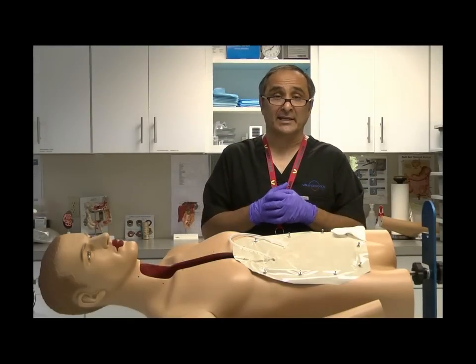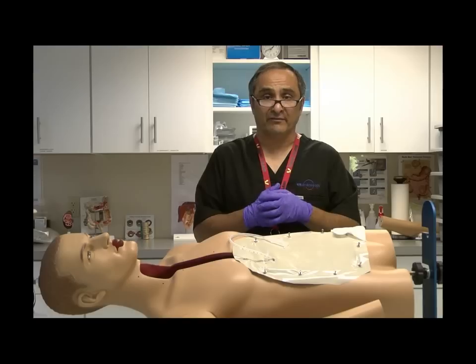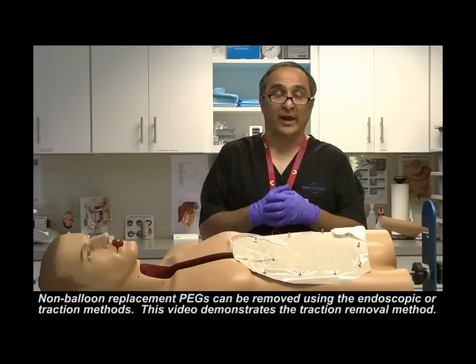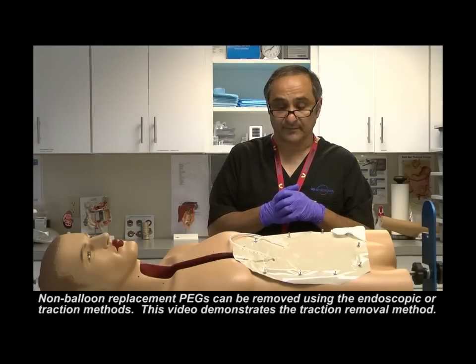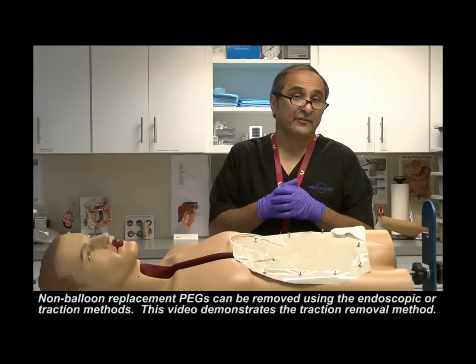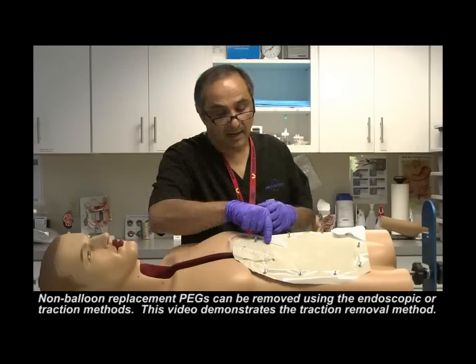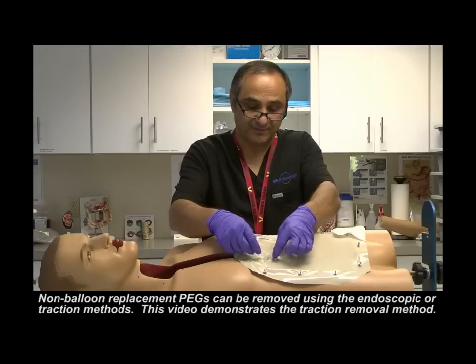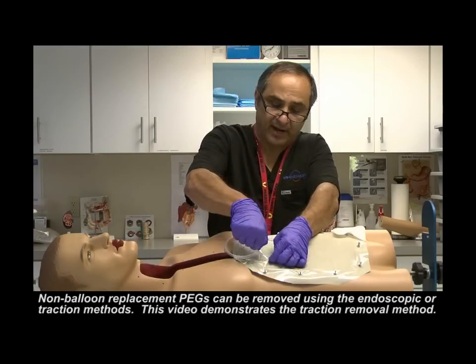What I'm going to demonstrate now is the removal of the device. As you're well aware of, this is also a traction removal device. Proper technique is as follows. I'm going to take the external bolster and slide it up the tube first. And I just simply grab and slide it up.